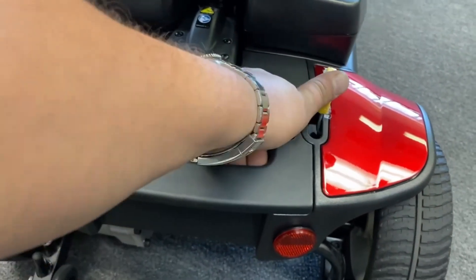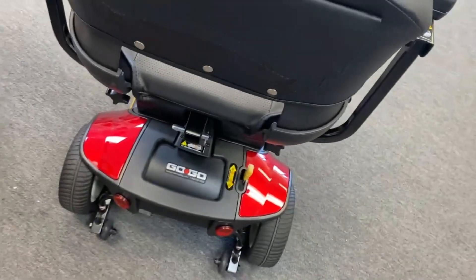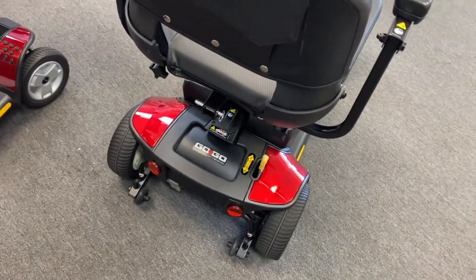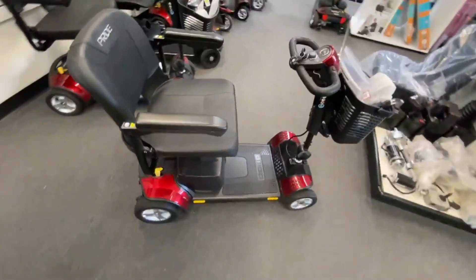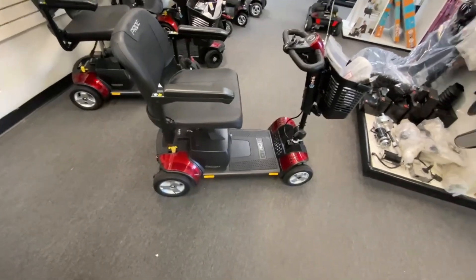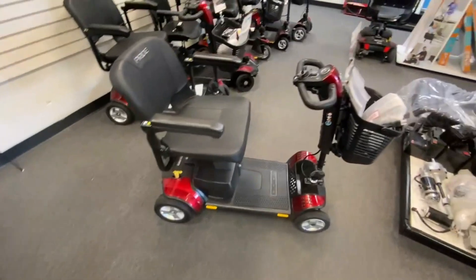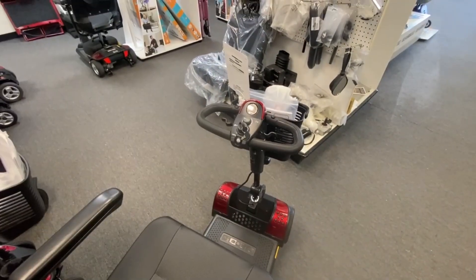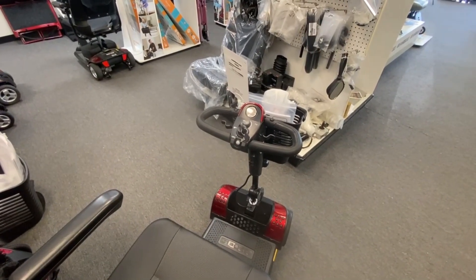But if you do leave it in neutral position — maybe you catch the handle unknowingly, or you move the scooter around in the house — and forget to put that handle back in the drive position, the lock position, then the scooter will usually indicate either by an audible beep or a flash.